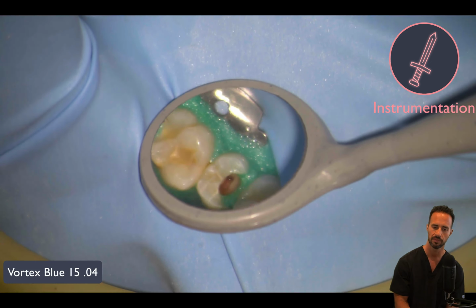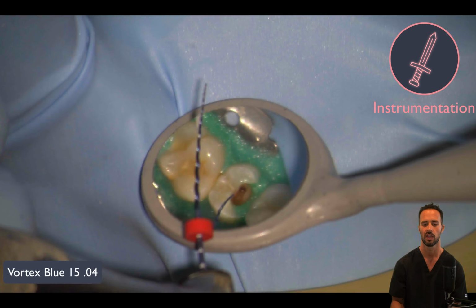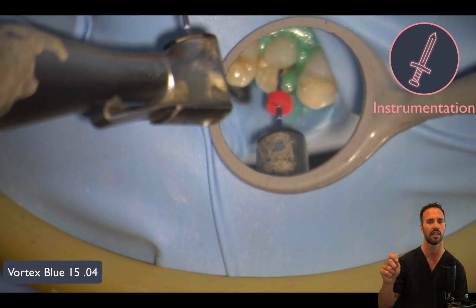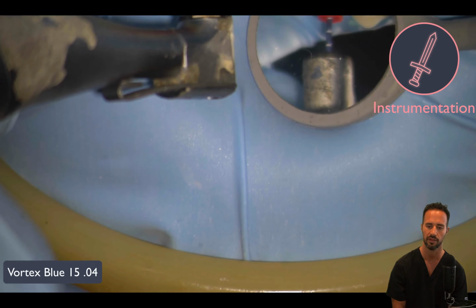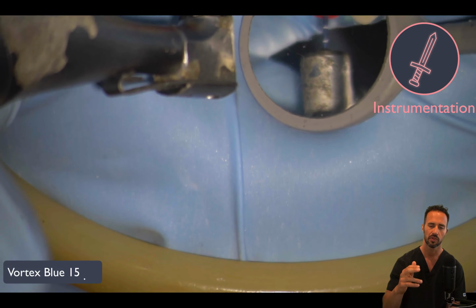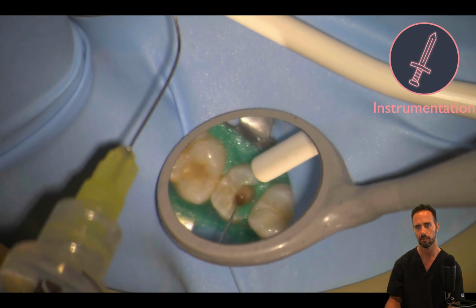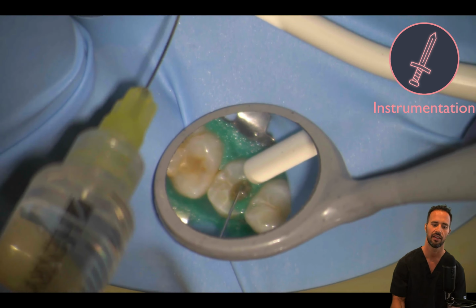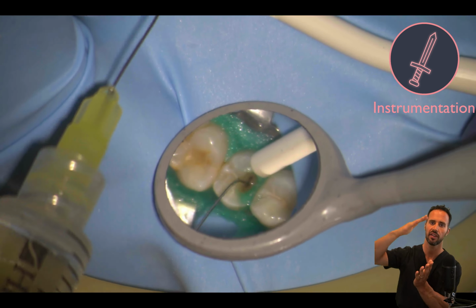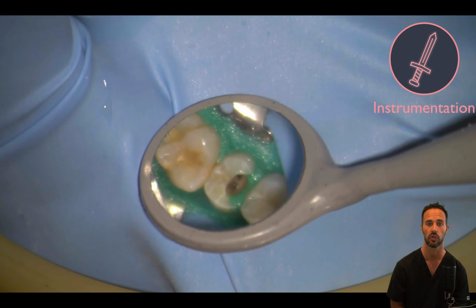First in the buccal, to length, remove, wipe the file, put some EDTA or some RC Prep on the file, and then go and do the same thing for the palatal, okay? So that's the routine. Rotary to length, remove, wipe, RC Prep, rotary to length in the other canal, and then irrigation between every increase in file size, all right, with our half-strength sodium hypochlorite.